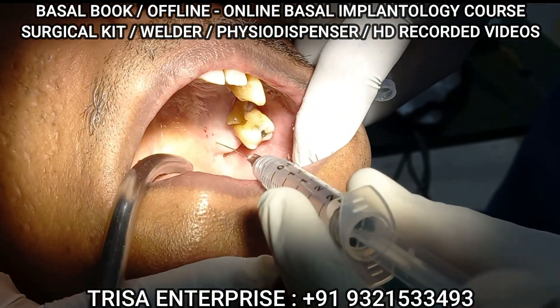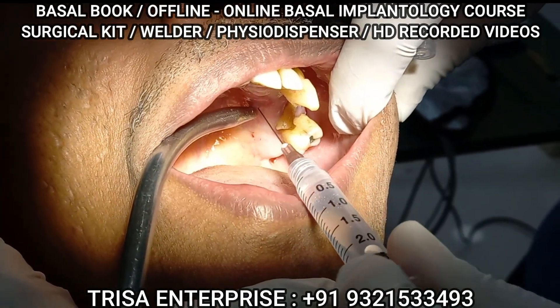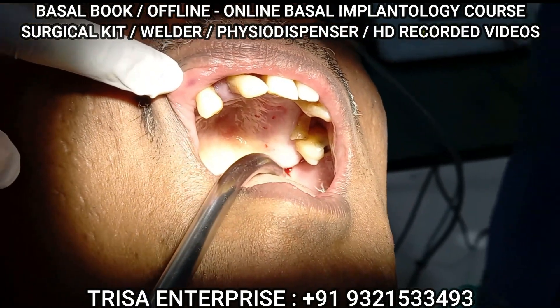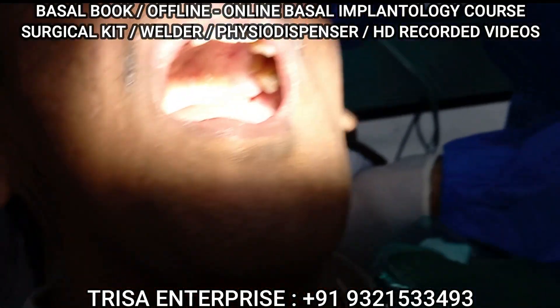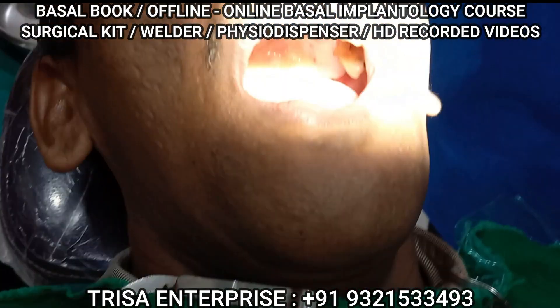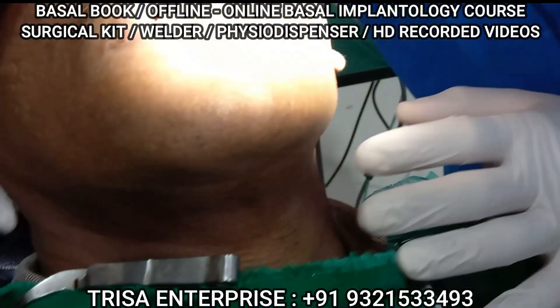For a first time, just expect the molar — that will give me a good vision of the pterygoid area. Just give an eye pack to the patient, please. Just relax yourself. Are you comfortable? Is the head rest comfortable? Fine. If anything is there, please let us know. Just keep an eye pack on, and you can raise your hand and we will surely stop immediately.